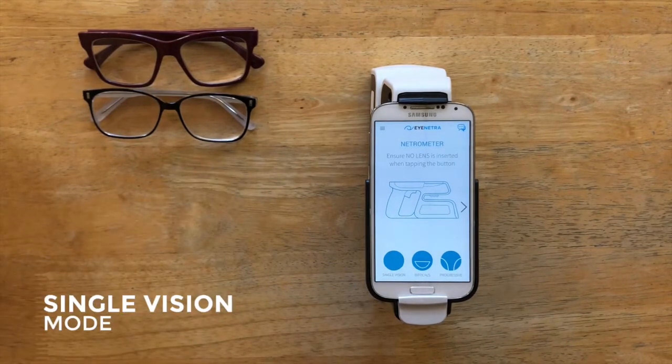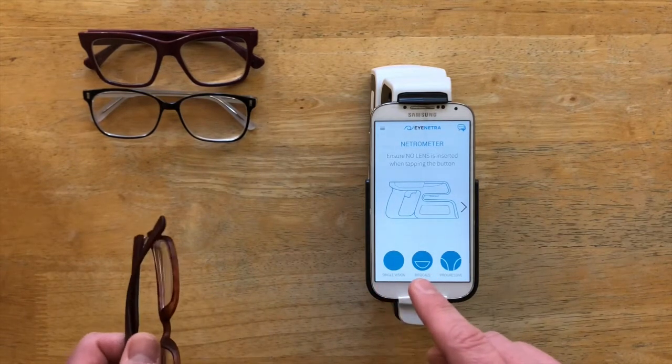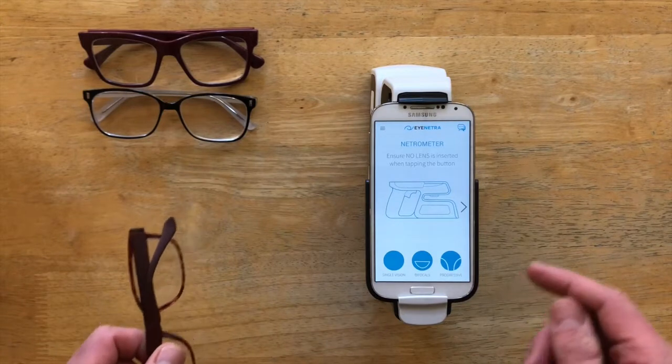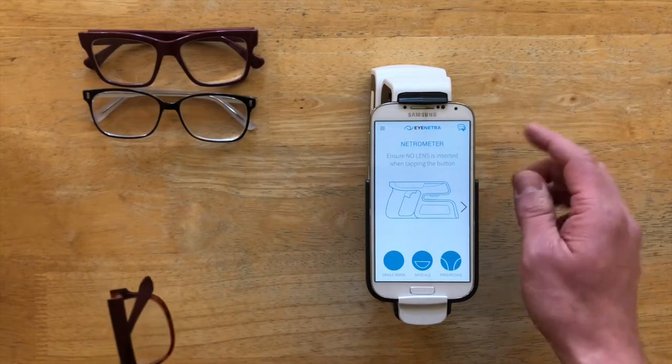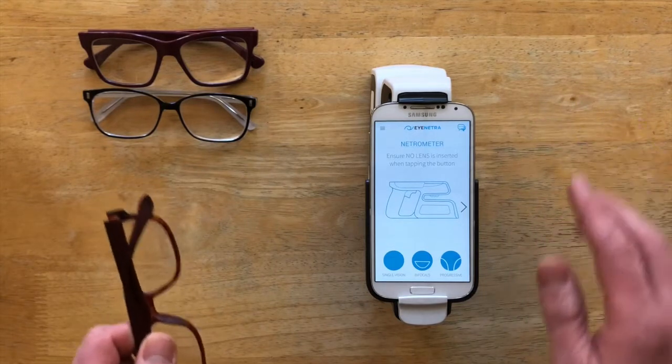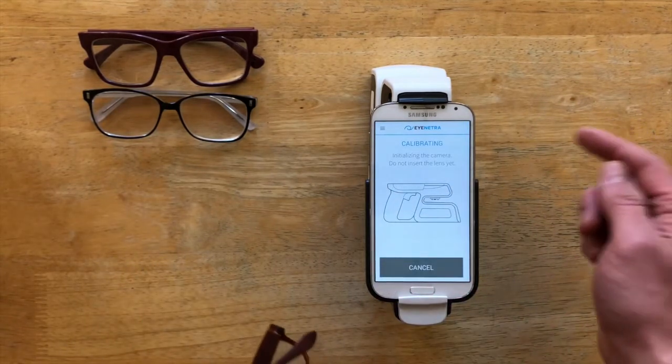Now the most important rule when using the Netrometer is when you first select the mode, whether it be single vision, bifocals, or progressives, it's very important that there's no glasses inside the mouth of the Netrometer at that time, as it's going to take a quick second to calibrate. So I'll start by selecting single vision, allow the device to calibrate.